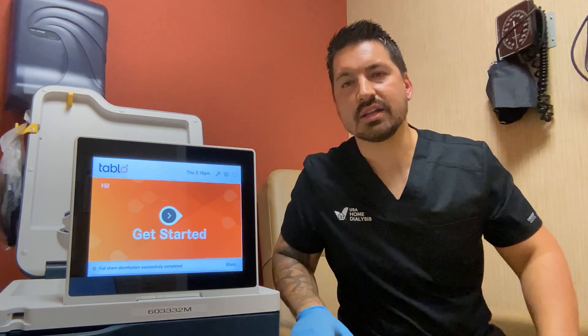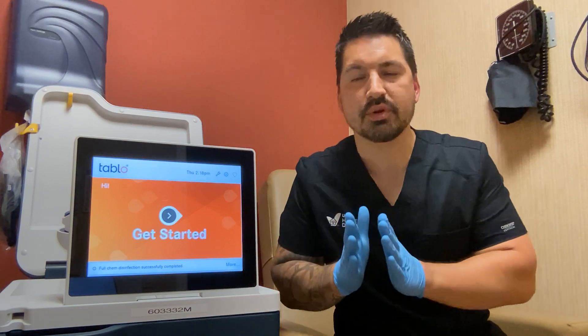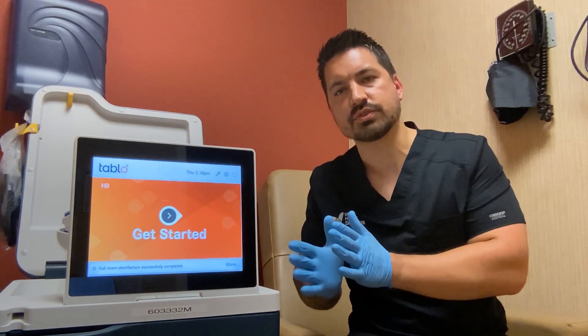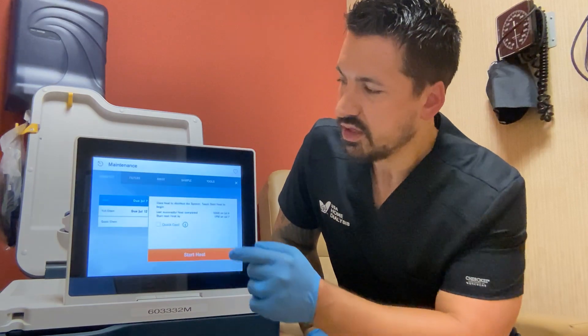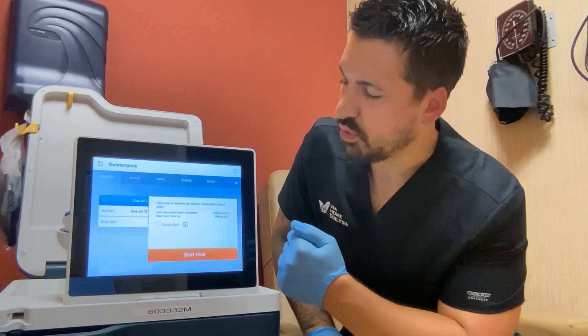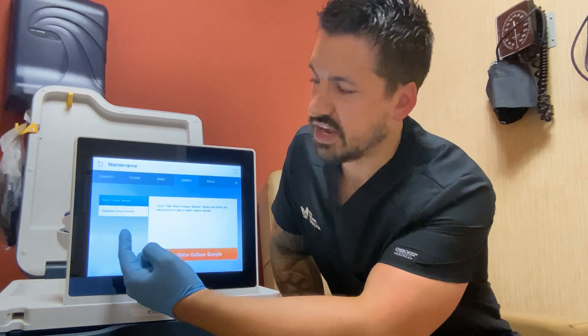Let's talk about the dialysate water cultures you need to collect. At this point you should have already learned how to collect water cultures. You need to keep this separate in your mind from dialysate cultures. Water cultures are different from dialysate cultures. If you click on the wrench up here, that'll bring you into this table with all these options. Click on the sample button at the top and you'll see two options on the left: water culture sample and dialysate culture sample.